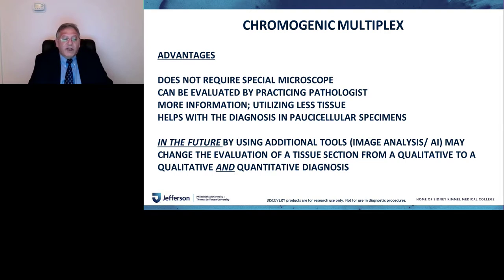Also now, if you think about it, just by looking at the slide, if you have a multicolor, multiplex immunohistochemical slide, you are getting so much more information just by looking at a single slide. And it's very helpful in the diagnosis of paucicellular specimens in cytology.